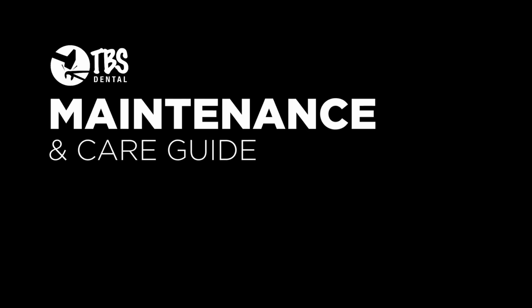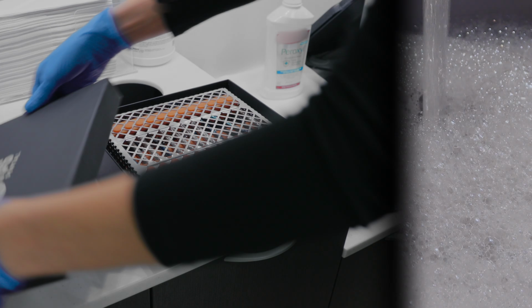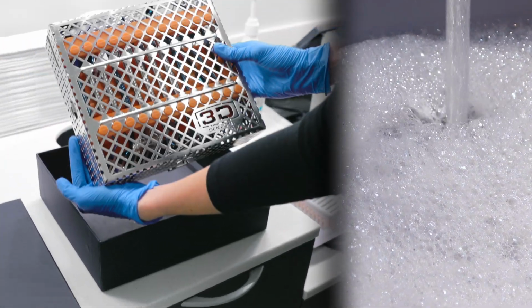TBS Dental, Instruments Maintenance and Care Guide, 3-Step Simple Cleaning. Note: wash all new instruments with warm soapy solution prior to first sterilization cycle.